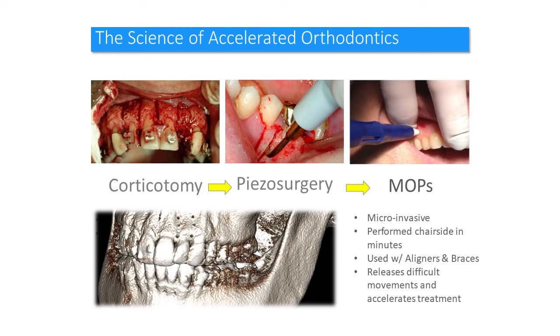And we take the Propel driver and we make dimples into the bone, righty-tighty, lefty-loosey. So if we look at the bottom picture of the x-ray, we look at the dimple in the bone, and we compare that to how much traumatization we have in the picture above it with the Wilckodontics, you'd think that we have more traumatization in the upper picture than the lower picture, and therefore we would get an increased rate of movement on the top.